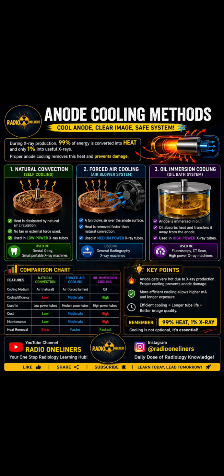Now the question is, where do we use this? We use this in high power machines like CT scan and fluoroscopy. Oil cooling is the most efficient one with the fastest heat removal, natural convection is the least efficient one, and forced air cooling is the medium one. So we have three methods which we use in radiology for anode cooling.